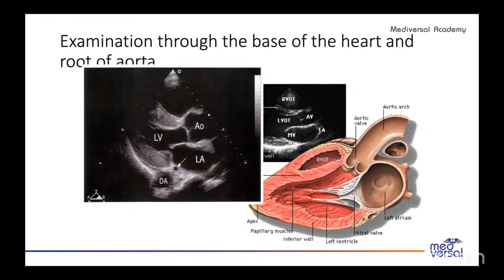the left ventricle, the interventricular septum. In between there is the interventricular septum, and the base part is where there is the inferior wall. So the inferior wall and the muscles along with it is the base part, and the upper part is the RVOT.